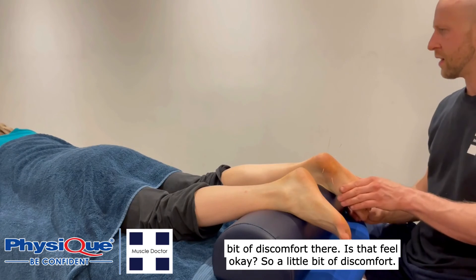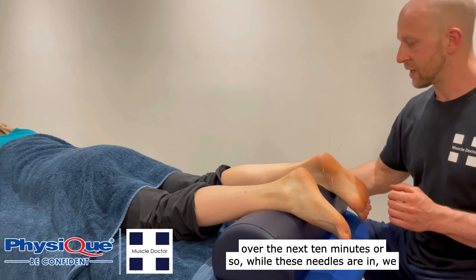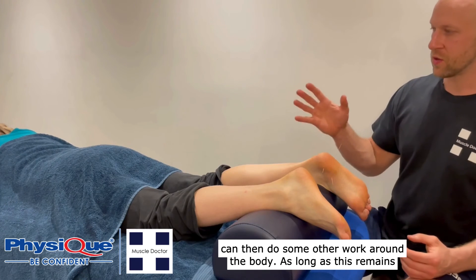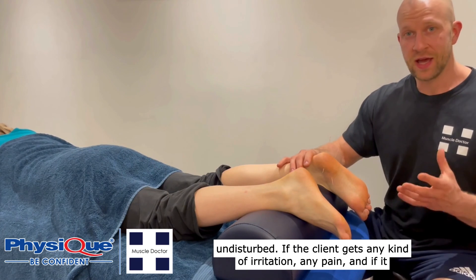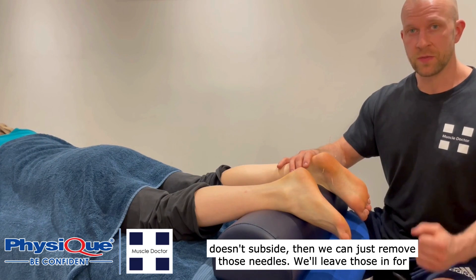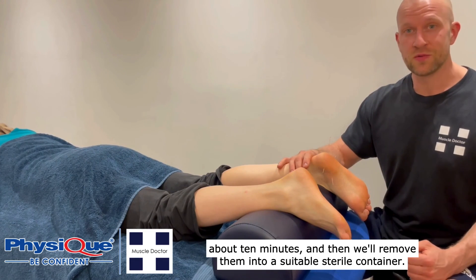Maybe a little bit of discomfort — does that feel okay? A little bit of discomfort but we're not going to go in any further. So we're going to monitor that now over the next 10 minutes or so while these needles are in. We can do some other work around the body as long as this remains undisturbed. If the client gets any kind of irritation or pain and it doesn't subside, then we can just remove those needles. We'll leave them in for about 10 minutes and then remove them into a suitable sterile container.